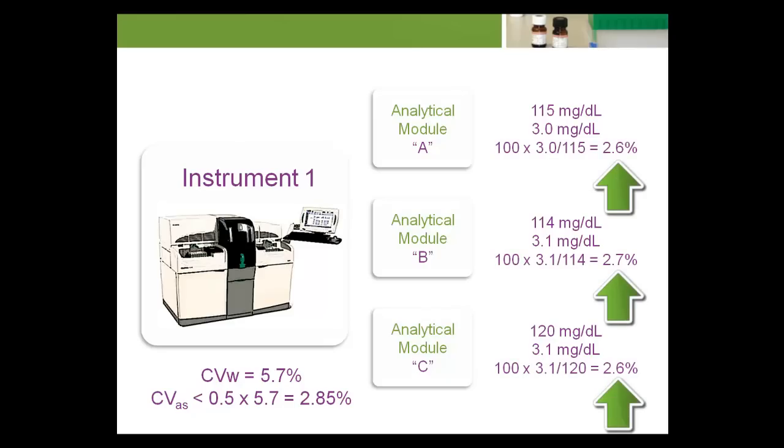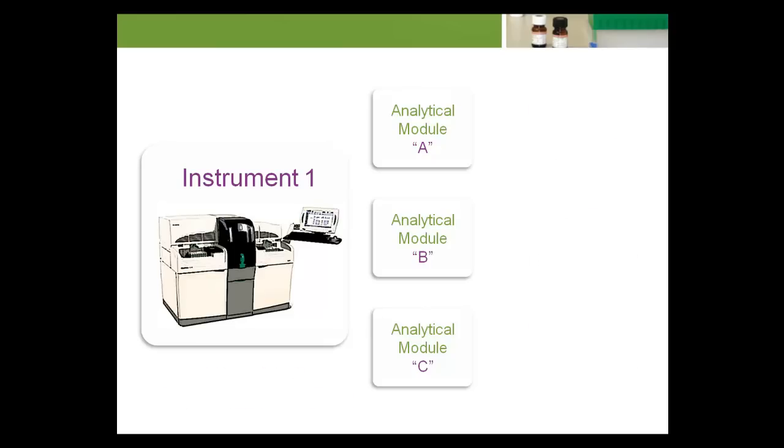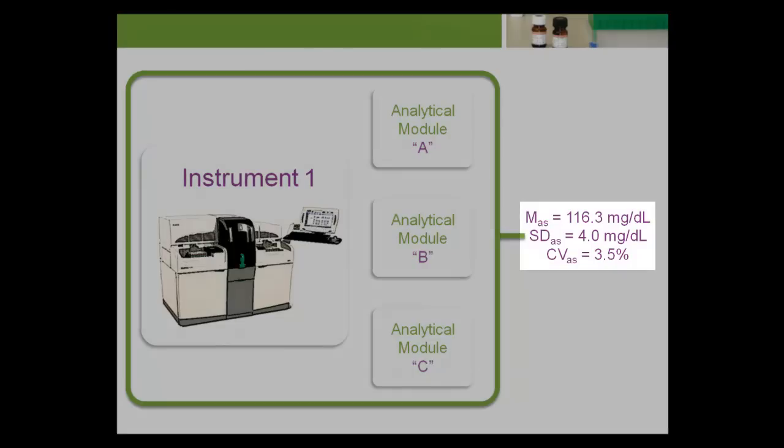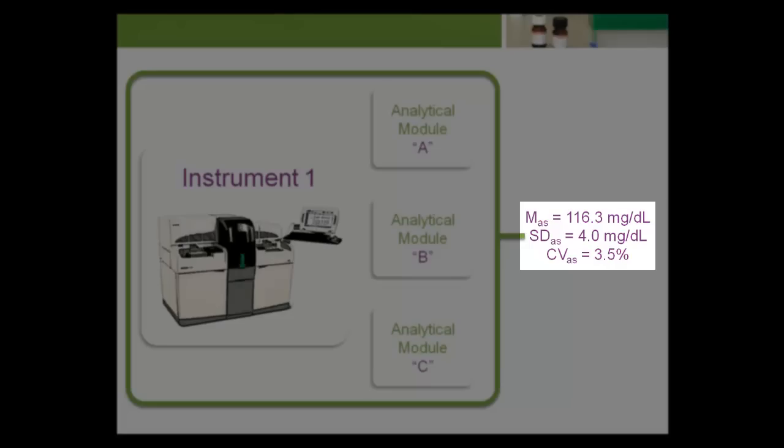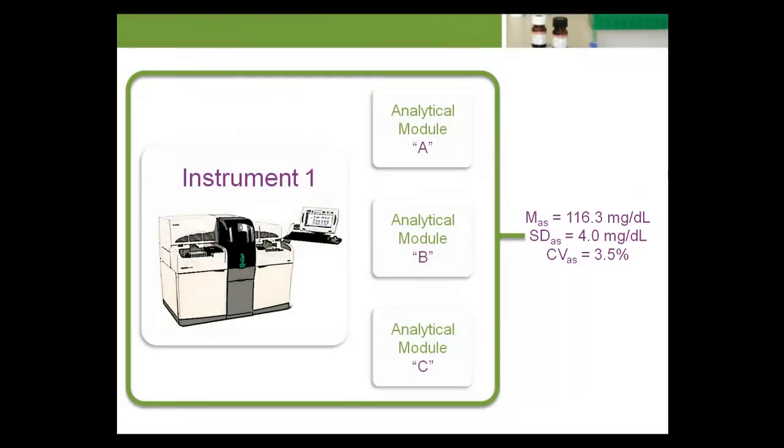Each individual module meets the less than 2.85% goal. However, applying the formulas for the total analytical system gives MAS equals 116.3 mg per deciliter, SDAS equals 4.0 mg per deciliter, and CVAS equals 3.5%, which does not meet the goal. The size of the bias between modules causes the total uncertainty of the test system to exceed the performance goal.